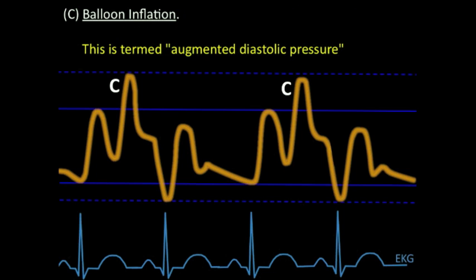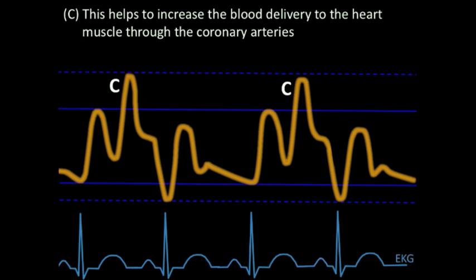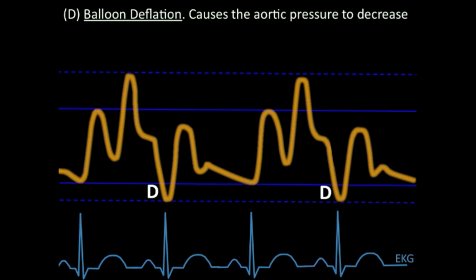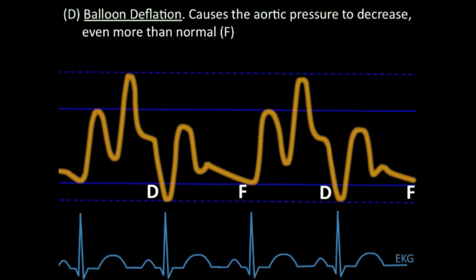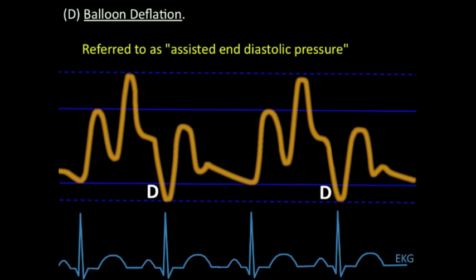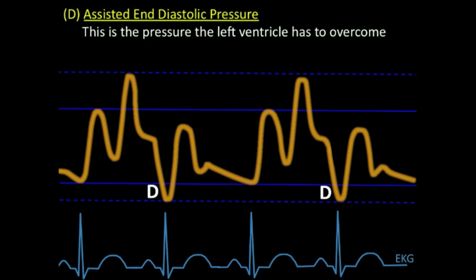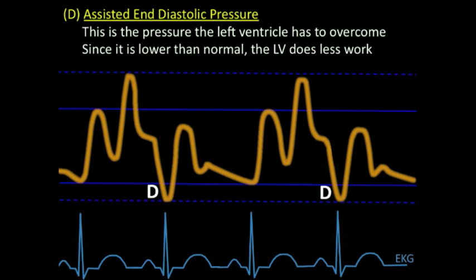The augmented diastolic pressure causes increased retrograde blood flow, thereby increasing blood flow to the coronary arteries. Letter D stands for end of diastole — this is where the balloon deflates, causing aortic pressure to drop quite suddenly. We've actually dropped further than we normally would have in diastole, so comparing D to F, the pressure is considerably lower with the balloon deflating. This is called the assisted end-diastolic pressure — not the LV end-diastolic pressure, but the aortic end-diastolic pressure. This is the pressure the left ventricle must overcome for the aortic valve to open again. If the assisted end-diastolic pressure is lower than normal, the ventricle doesn't have to work as hard to eject blood, reducing myocardial oxygen demand and decreasing afterload.